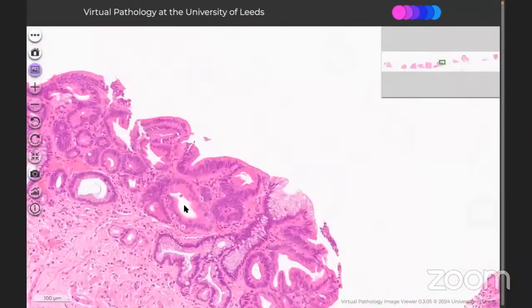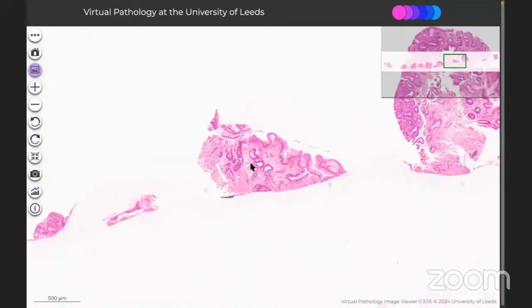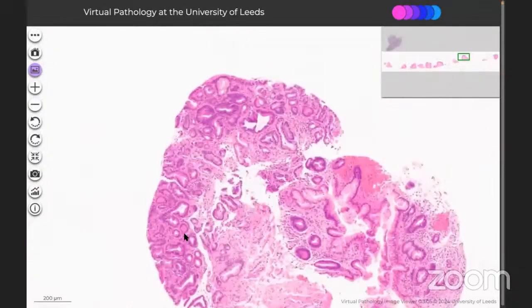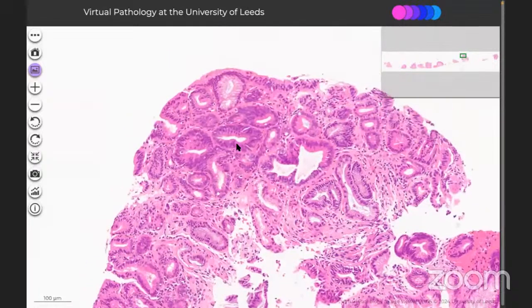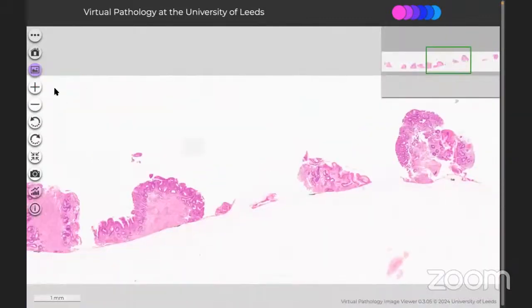Okay, so this is how you complete this step, and you say that this dysplasia is related with the age, the duration of Barrett's, GERD, and it can progress to adenocarcinoma unless it is treated. So this kind of message you can give in the additional information section. Okay, so this is how you deal with this case.